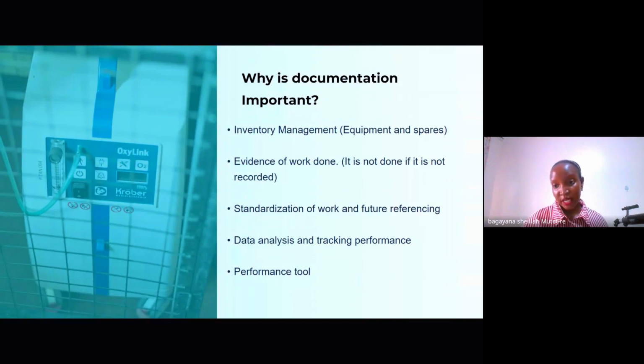For example, we say that an engineer who works with us, say who manages a hub, will be able to do maintenance of this number of concentrators. So what will actually gauge that is looking at the documents and seeing that they're actually doing this.